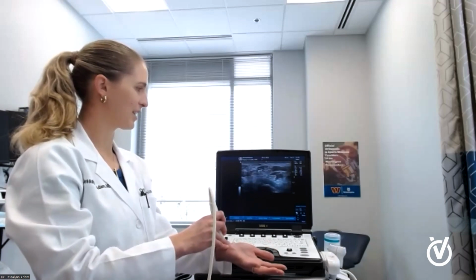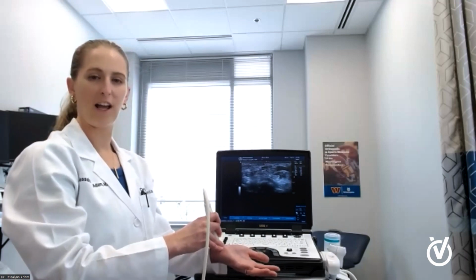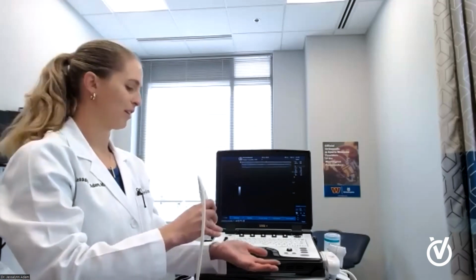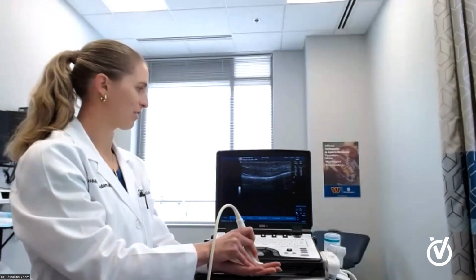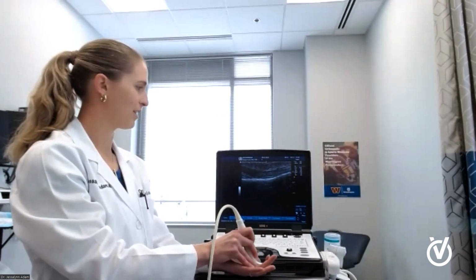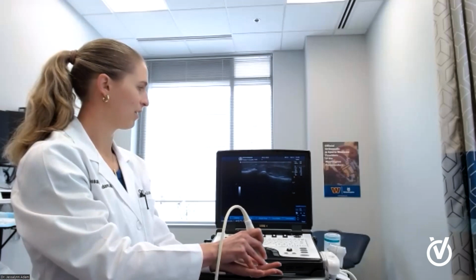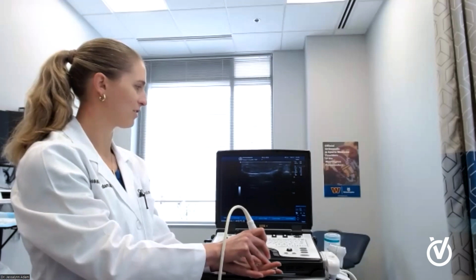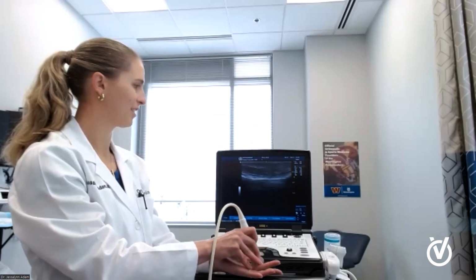So one of the really nice things about ultrasound, and I'd say a big advantage, is that we can look at things dynamically. For an MRI or an X-ray, you are staying still, but for an ultrasound, we can watch how things move. So if I move down to my finger here, say for instance, you're not sure if you injured your finger, you can actually see those tendons moving back and forth. And I can follow them all along their whole length to make sure that they are still connected and attached. There are no tears, fluid around the tendons or other abnormalities.